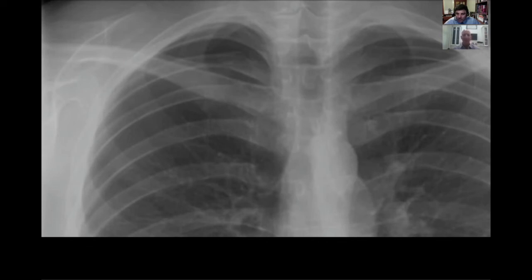Yeah, not really for me. I've tried a bunch of those different techniques, inverting the black and white scale and various things. But to me, honestly, it's just paying attention to history, and then, of course, zooming up. And we spend all day long zooming in and out, changing window level.